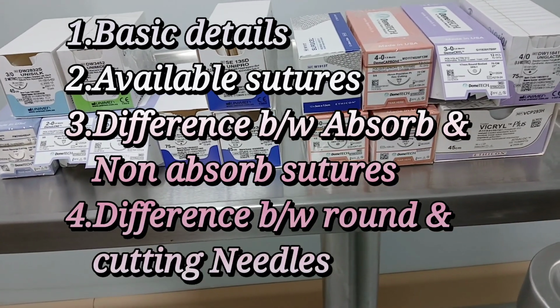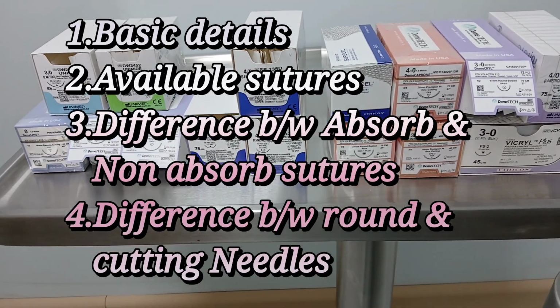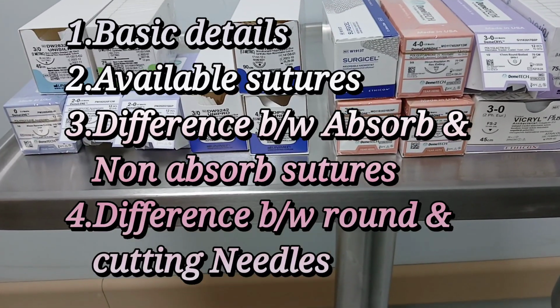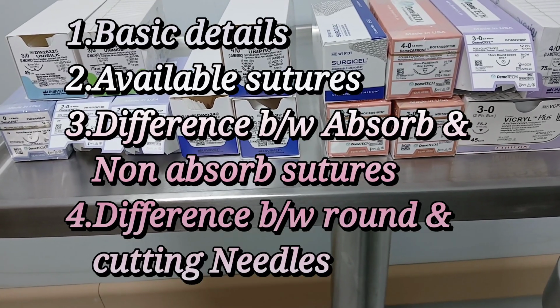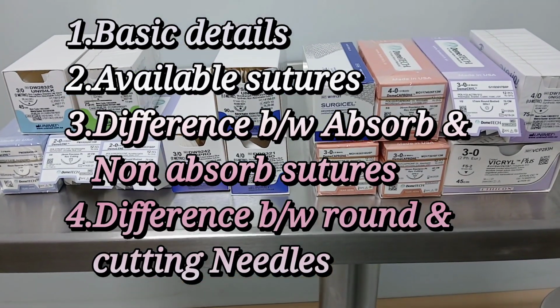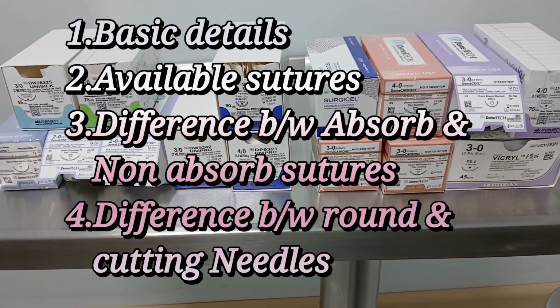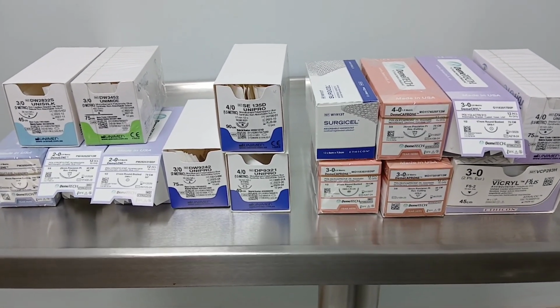And secondly, we are going to discuss what are the suture materials available. Third, we are going to see what is the difference between absorbed suture and non-absorbed suture. And finally, we are going to see how to differentiate a round body and cutting needle. So first I will explain how to check basic details of suture material.